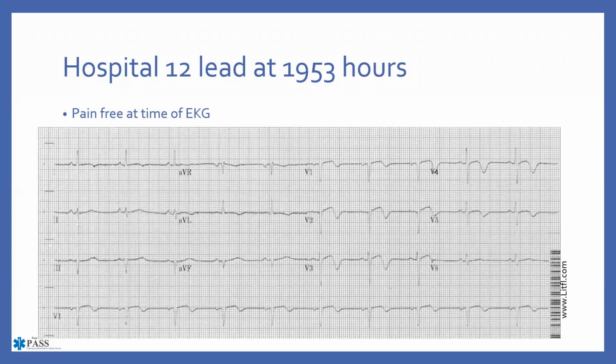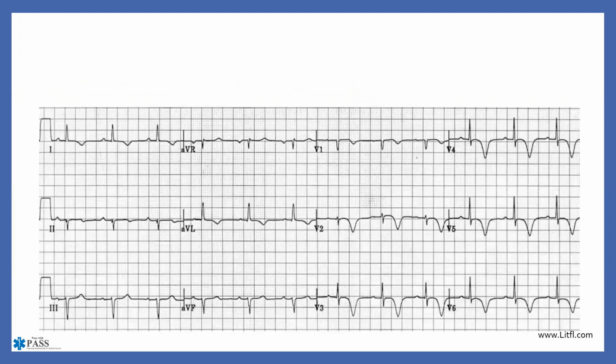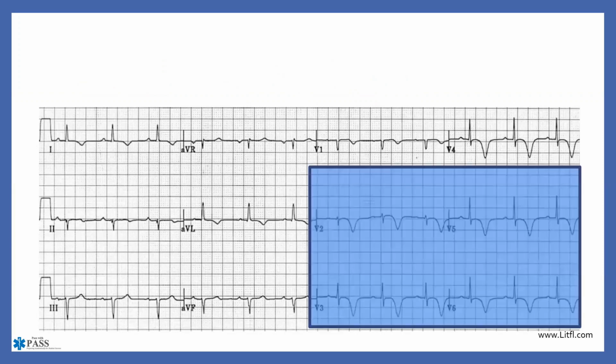And then ultimately we tell the patient, I don't see any STEMI pattern here. I think that you're okay. Follow up with your doctor, call us back tomorrow, whatever the deal is, when in fact the patient is having an infarction pattern. So you can see here the deeply inverted T waves for sure, and the biphasic T waves that go along with a patient that is having a Wellens syndrome. Same thing here. As we look, you can see that these T waves become very deeply inverted, which is problematic and indicative of the patient having a Wellens syndrome.